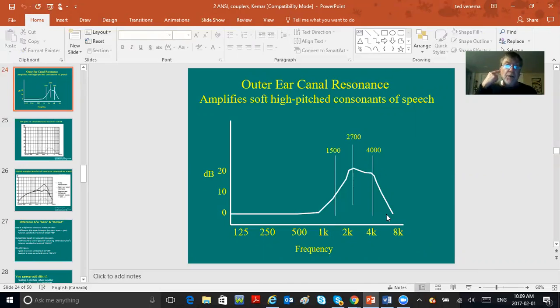And then, carefully holding the tube in the same place, make sure you don't move that tube, take the hearing aid and put it in the guy's ear, disturbing the tube as little as possible. Turn the volume to a comfortable position and have the very same sounds come out of the speaker again. Follow my cursor here: you would get a line above.